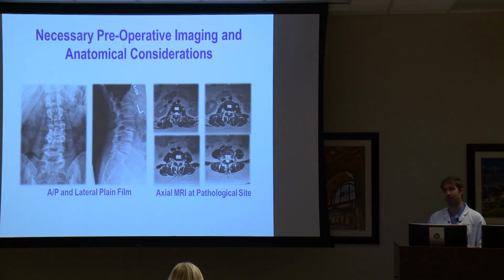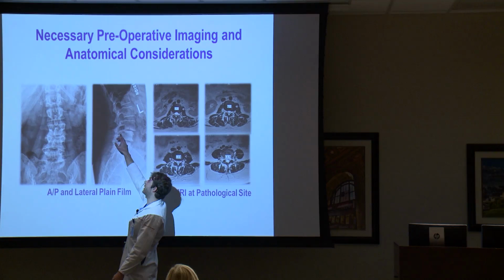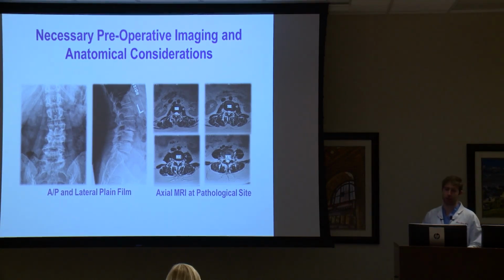So the 40 minutes or the 45 minutes or the hour, from going from the side, taking off all the tape, laying them down and being safe, padding up everything and going prone. You can keep them on their side and say, okay, I'm going to shoot screws on their side and lock them in. So if I did a lateral here, I could shoot screws while they're laying on their side. I've done it with x-ray before. It's tough. It's definitely a learned skill. I'm getting better at it. The first time I did it, it was a nightmare, but you've got to keep doing it to get better at it. But if you did it with nav, it would be real slick.